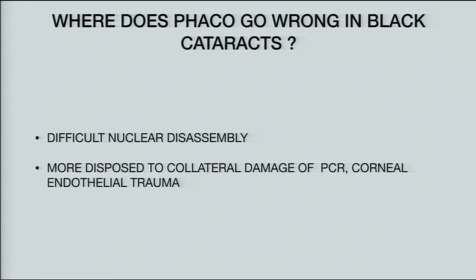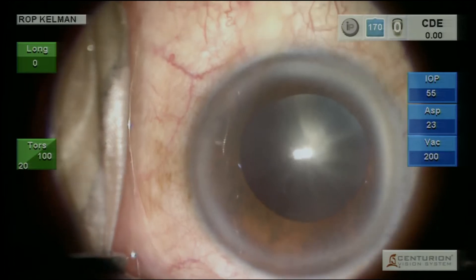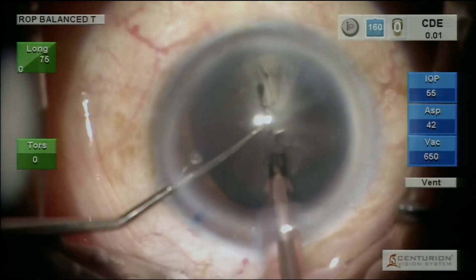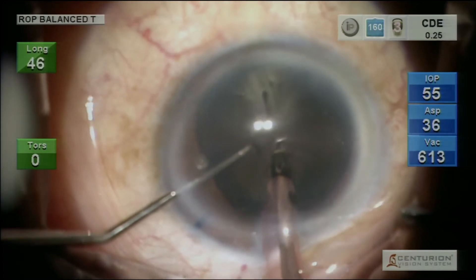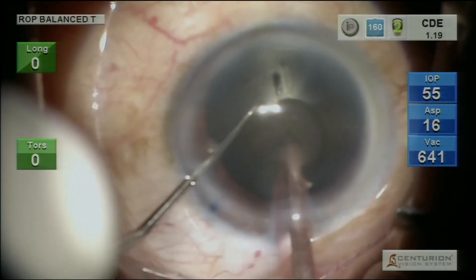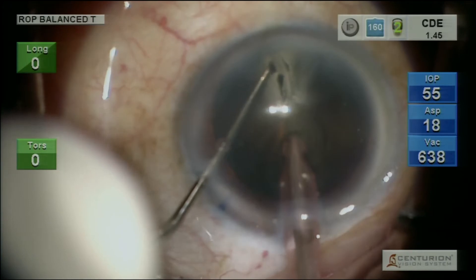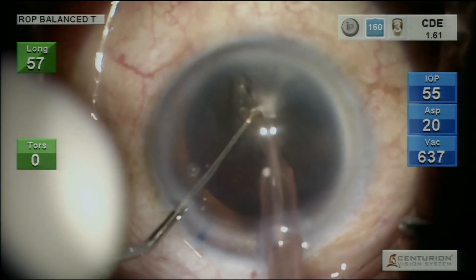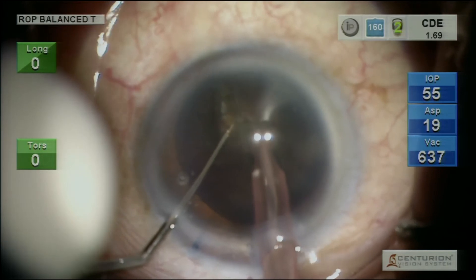So where does phaco go wrong in black cataracts? Because there's difficult nuclear disassembly, more disposed to collateral damage of PCR, corneal endothelial trauma — all these things. Let's see this video. This is a jet black cataract for all purposes. What are the things which need to be done? Longitudinal phaco, deep into it. And the first problem was creating initial cleavage planes.